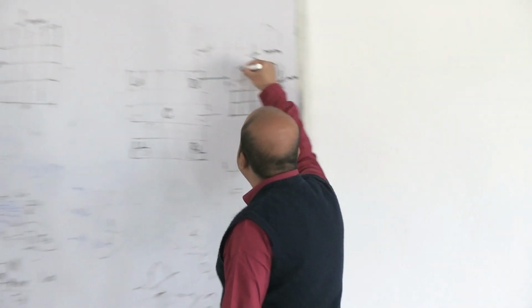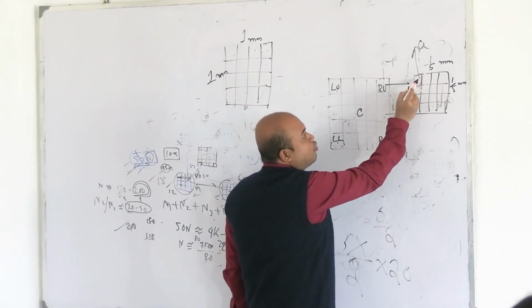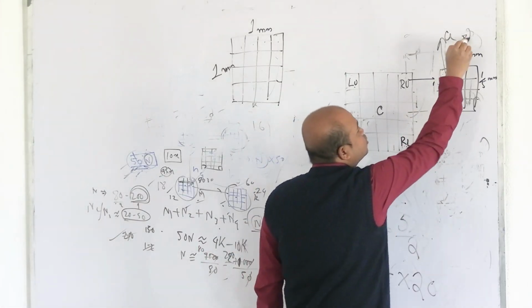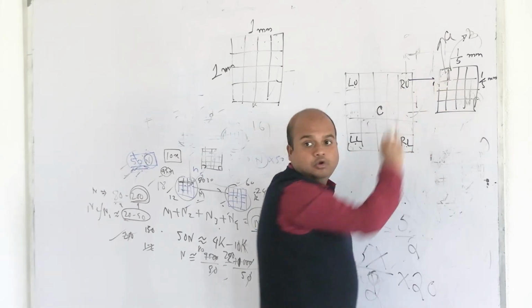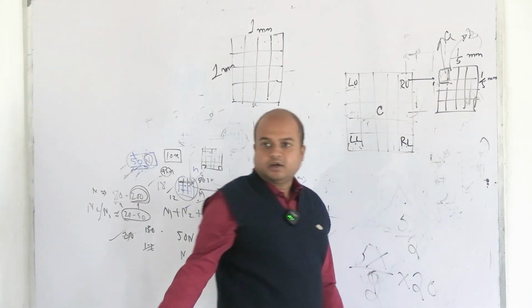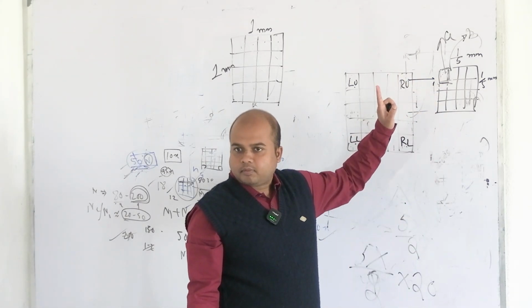So that square, if you name it as small a, while counting that square, if I count all the 4 margins, the central portion will be counted, all the 4 margins. There is a possibility when I count this B square, what will happen? I again count this, and these cells are double counted twice. So it is done, the left and lower margins are considered, but the right and upper margins are left out.